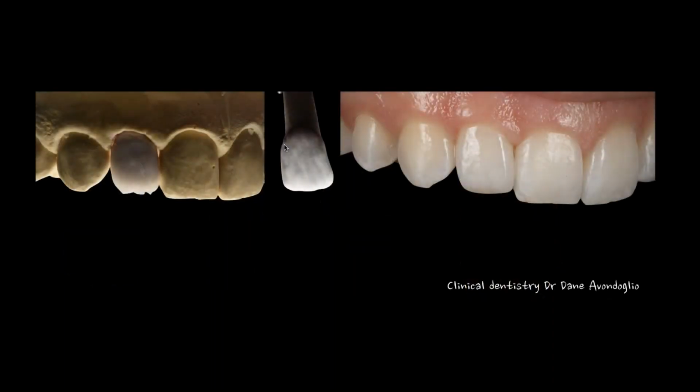And especially if I'm doing anything veneer-wise, that's all feldspathic materials. And that's kind of where you get the most usage in understanding material, especially in cases where there is zero space. Like this particular case as an example, I literally had 1 to 2/10 of a millimeter to restore that tooth, and it was a no prep veneer.